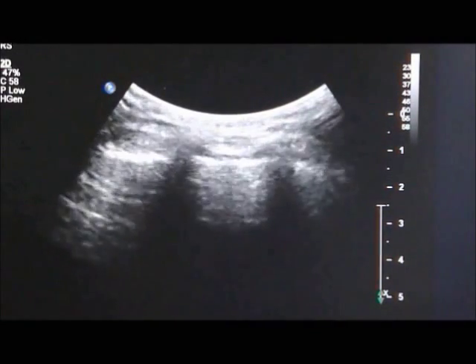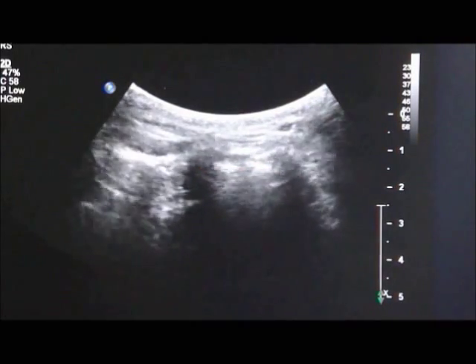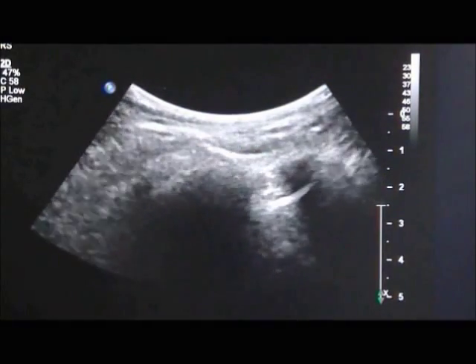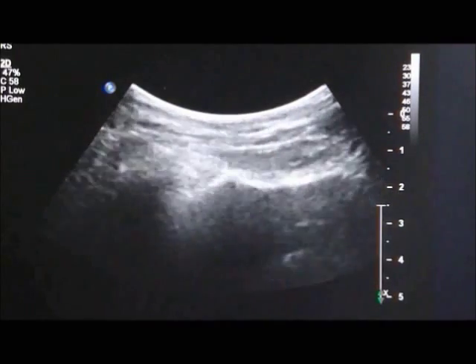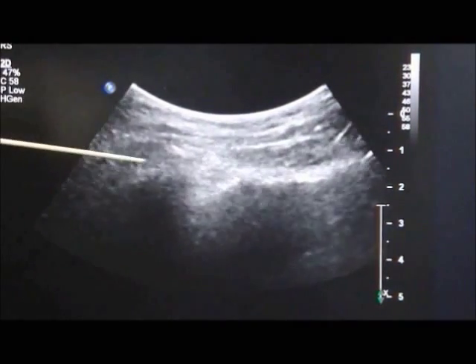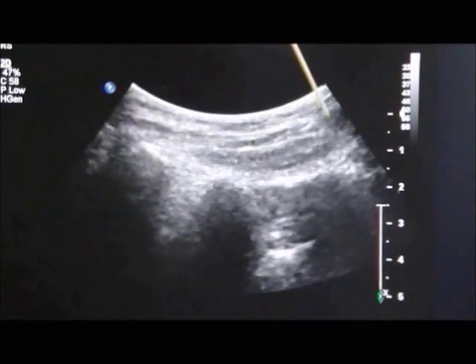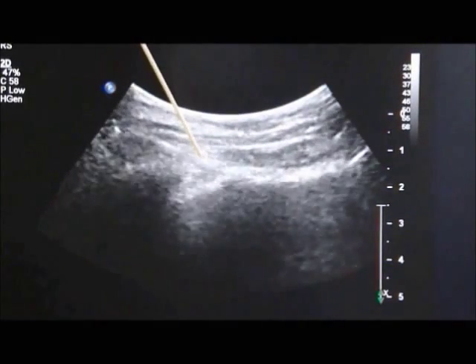The curvilinear transducer is used to identify the sacral hiatus first, and then the transducer is moved in a lateral direction until the lateral edge of the sacrum is observed. Then the transducer is moved in a cephalad direction until the sacroiliac joint is observed. This is the sacroiliac joint at the left side, and the injection needle will be approached in this direction to inject the injectant into the sacroiliac joint.